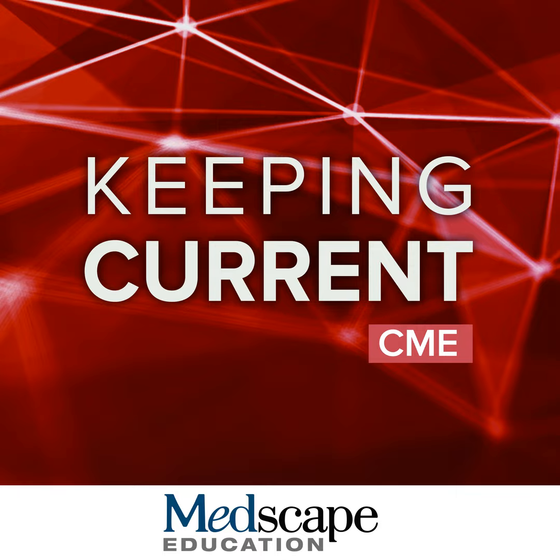And so here I'm sharing with you the ACR, American College of Radiology, updated appropriateness criteria in 2024. And you can see that brain MRI, amyloid PET, head CT, and FDG PET may all be appropriate depending on the scenario.